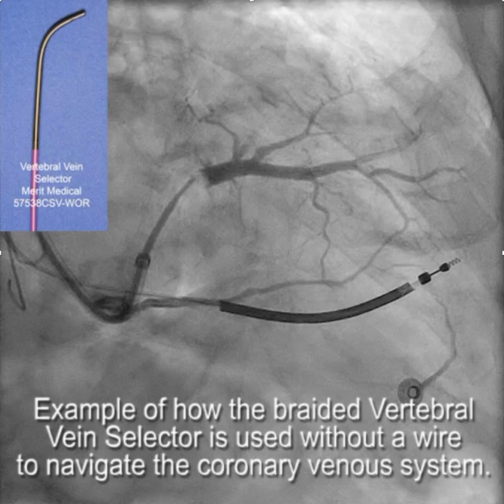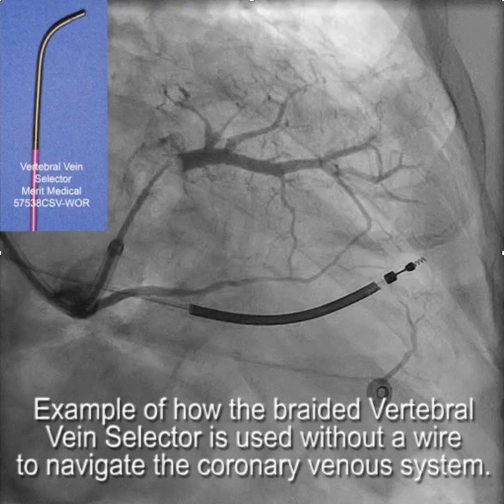A nice feature of the vein selectors is that they can be used not only in the coronary sinus but also within the branch veins to direct the wire where you want it to go, so you can navigate within the venous system. This is an example of how the braided vertebral vein selector is used without a wire to navigate in the coronary venous system.